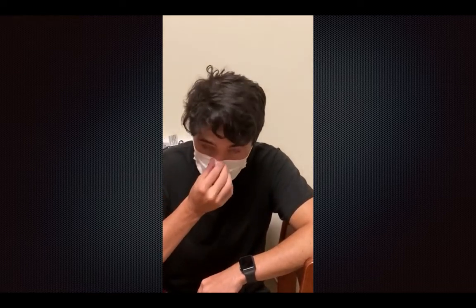Due to children growing, such as the patient mentioned before, oftentimes osseointegration is an impossible move for a growing boy. Therefore, we need cheap, effective models that could be printed readily and designed custom-made for any dimensions of the kid. In doing this, I learned that for my design, I would use 3D printed parts to make them cheap and include a Velcro strap to make it easily taken on and off.